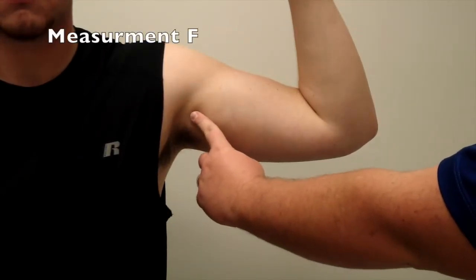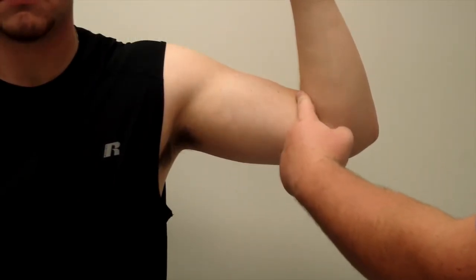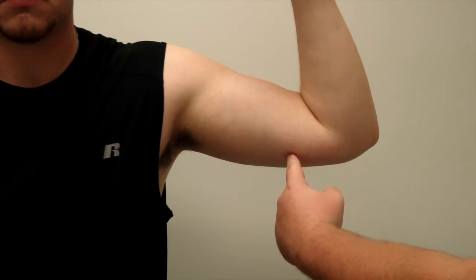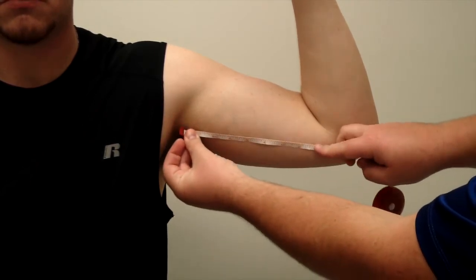Measurement F. Measure the distance from the axilla, or armpit, to the crease created by the contact between the bicep and the forearm when the arm is flexed.